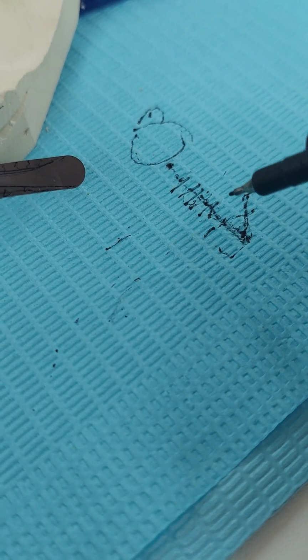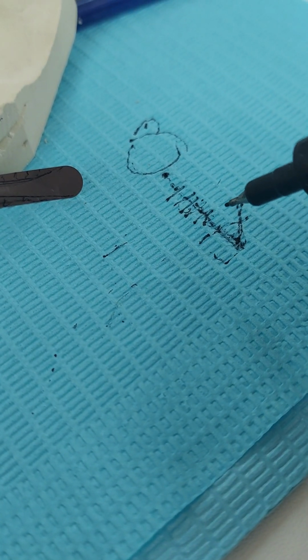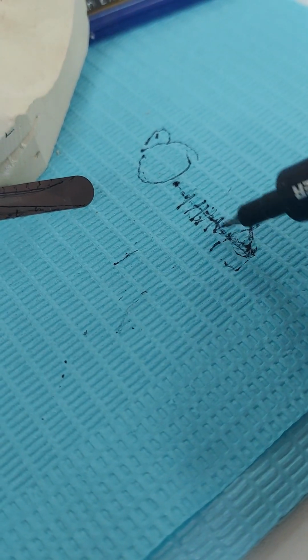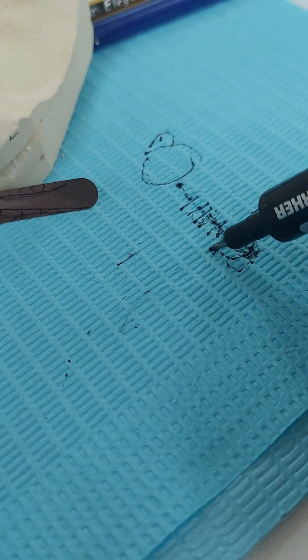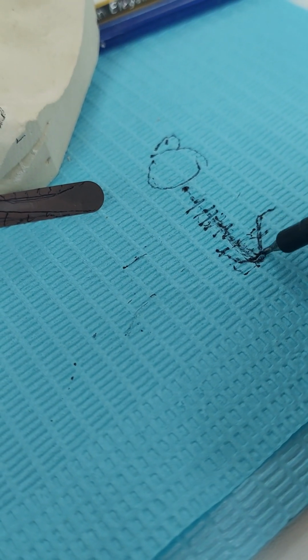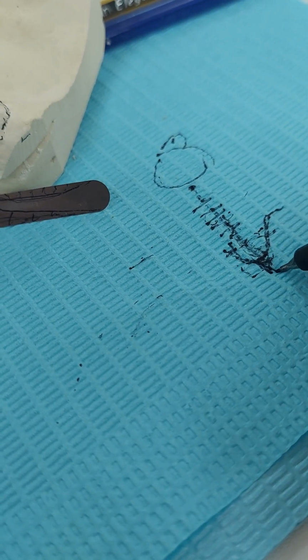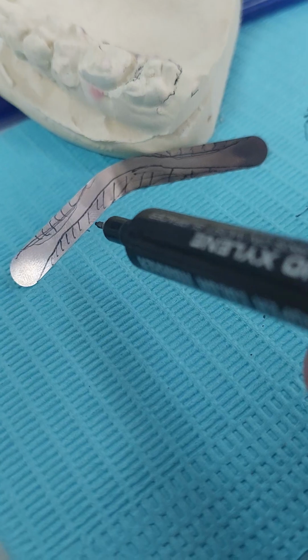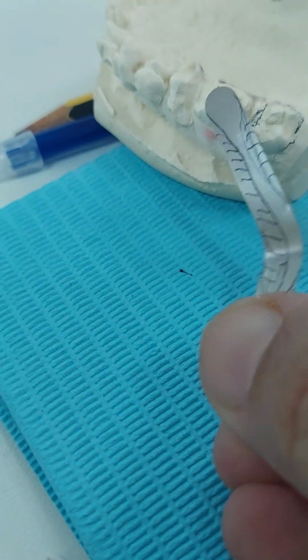So this deep gingival matrix is specified only to build up the first 2 millimeters, not horizontally, sorry, vertically, but in a rounded manner. It will take the correct emergence profile from the tooth. So it will be in this direction. Why? Because you see, I'm going to cut it. All of this is cut. Let's say this is the direction of it.